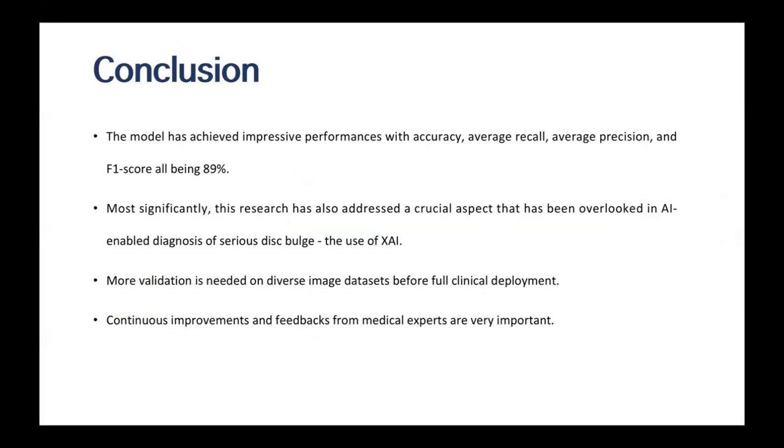So we introduced the concept of explainable AI into our study to gain trust, because it's not okay to build a model that has a good score and does prediction, but if it's to be adopted in the medical space, then we need explanations on how the model arrives at its decision.